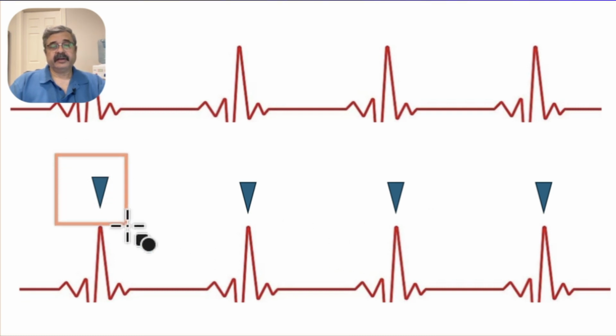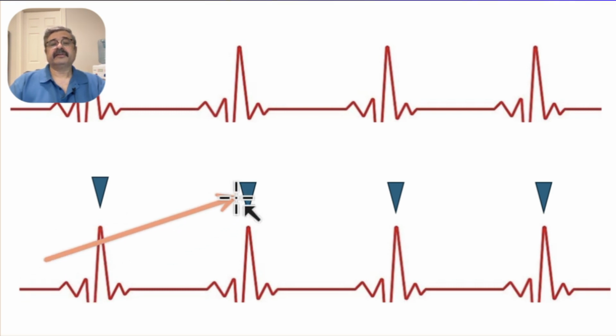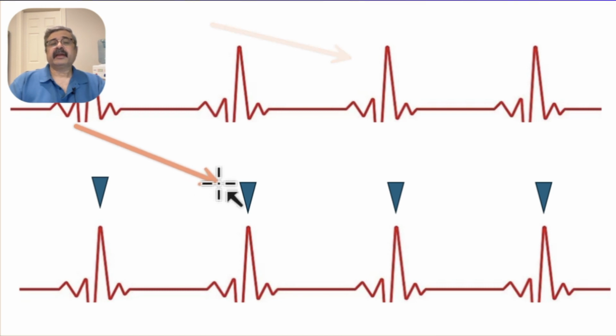This is being done in this specific fashion, that is, display of these inverted triangles on the R wave is another level of recognition of the EKG signal, which means in this specific case the EKG is being displayed, and the R waves are being recognized to prevent accidental shocking of the patient when you press the shock button, or to prevent an R-on-T phenomenon that converts a stable into an unstable rhythm.